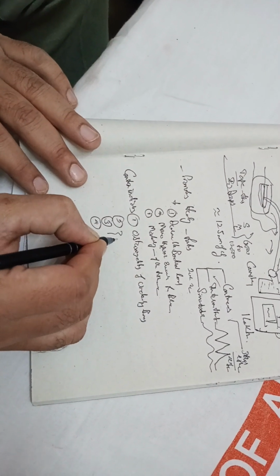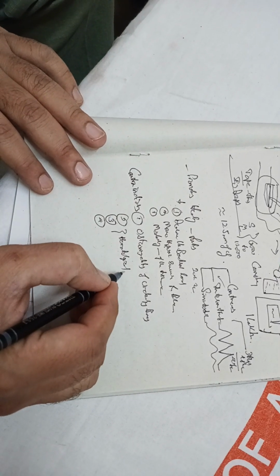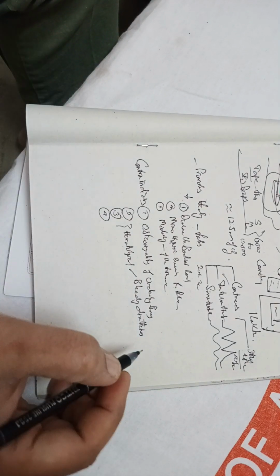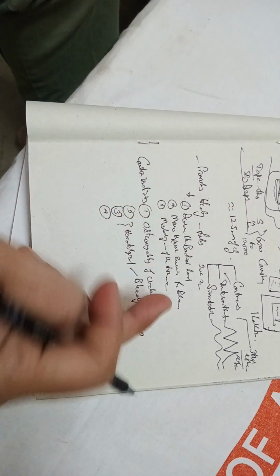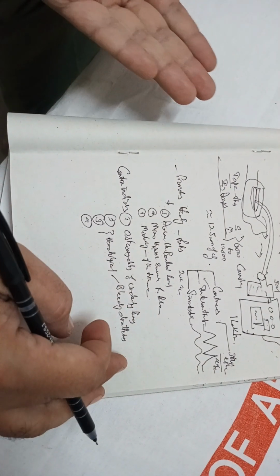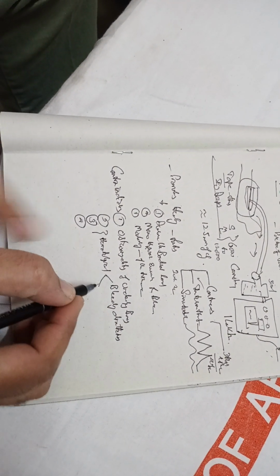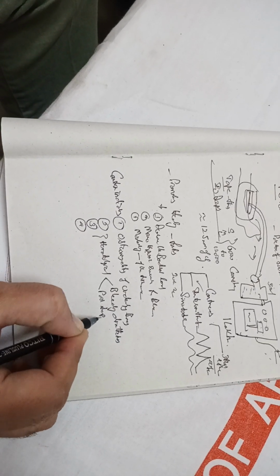The second two contraindications are hematological related. One is if there is bleeding diathesis, that means there is a coagulation defect. What happens if you put the VAC? Bleeding will happen, the suction. It is nothing but hemorrhage. The patient will end up in a hemorrhagic shock. So you should not use it. The second hematological one is poor supply.